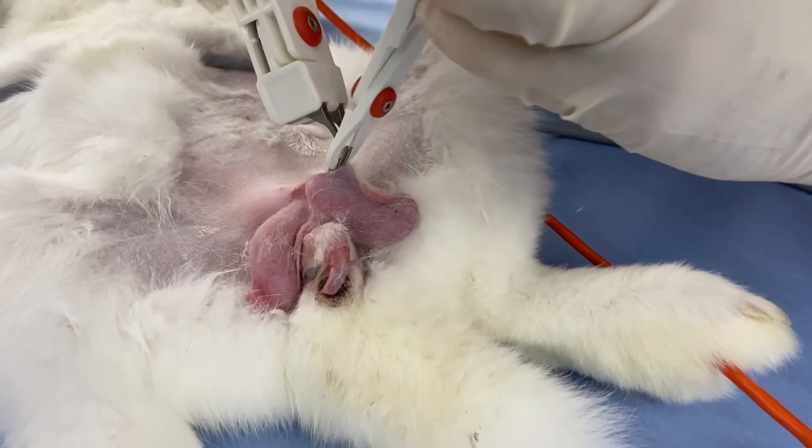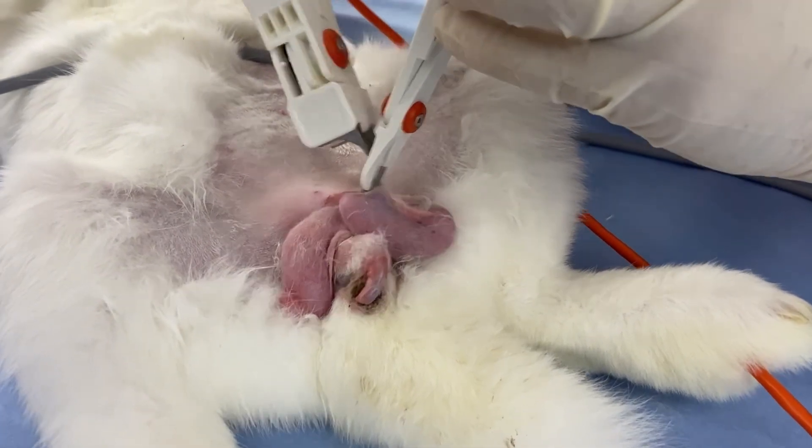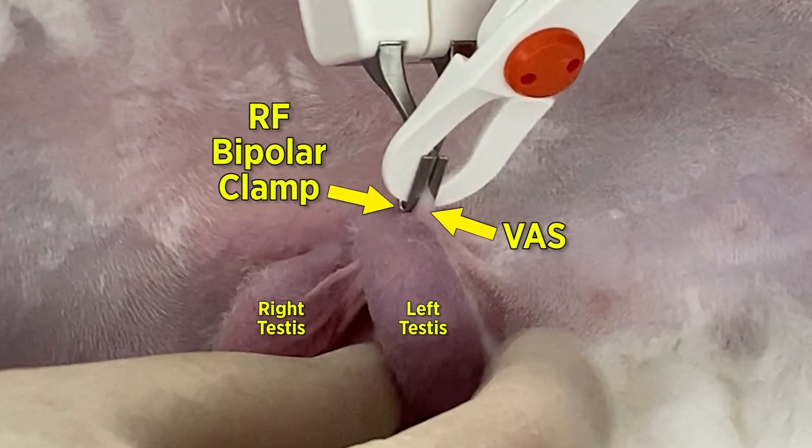My name is Sharonna Tillman. I am a nurse with Dr. Henry in urology, and I have over 25 years of experience. With the seal vasectomy tool, there's no bleeding, no swelling, and you're right back to work the same day. One of the first things I looked at was safety. The device we've created with our proprietary jaws uses bipolar vessel sealing, which studies prove is one of the safest methods for reduced swelling and quality of seal — a better seal than what has been out there for electrosurgical devices.